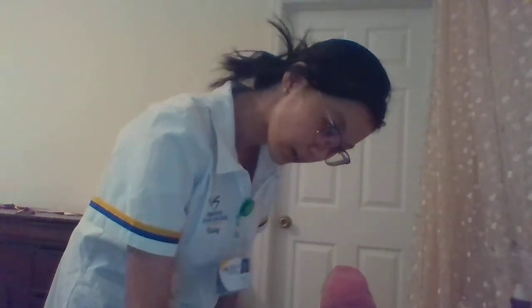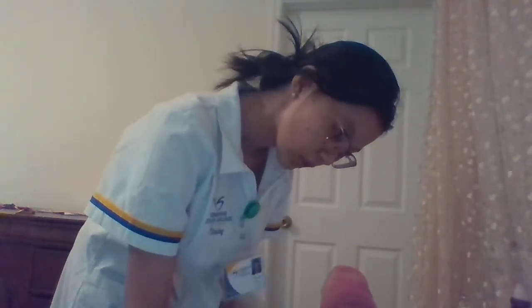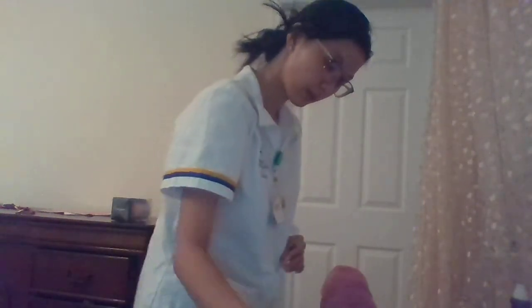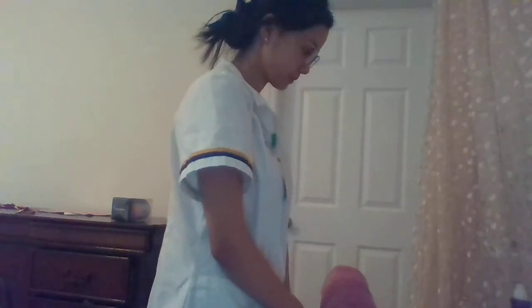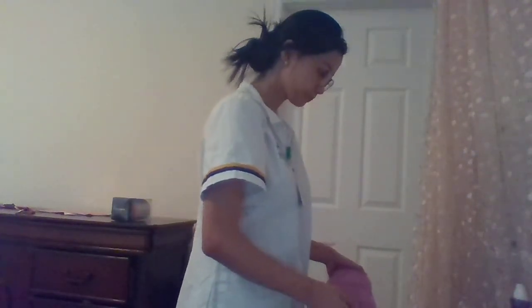So the patient is Anna Pulaski, and it is Anna Pulaski. The time is the correct time, and the route is intramuscular. And it's 0.5 milliliters, and the route is intramuscular. And I'm going to document it after I'm done checking that.